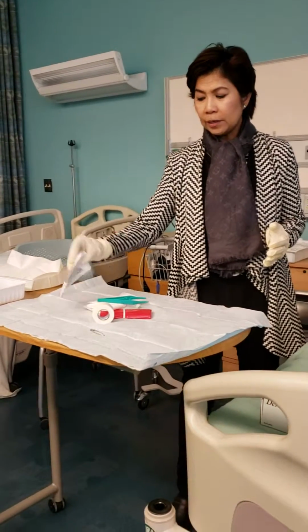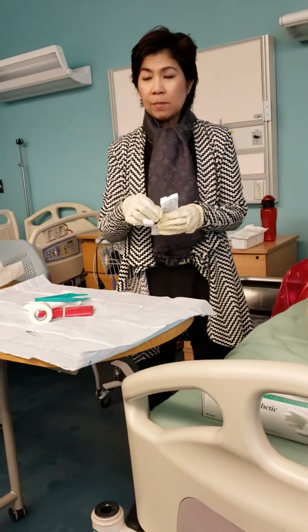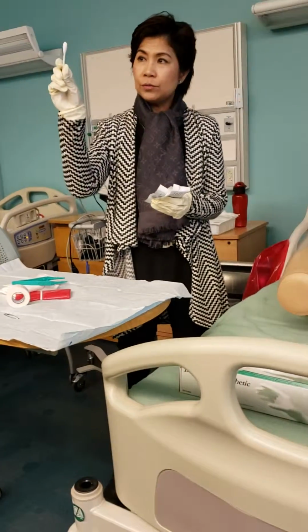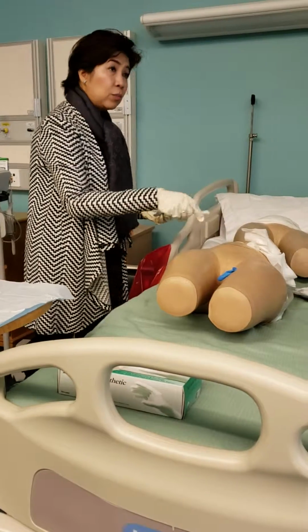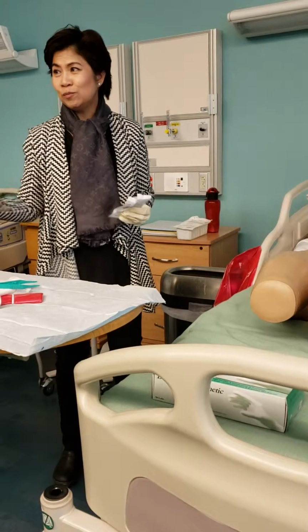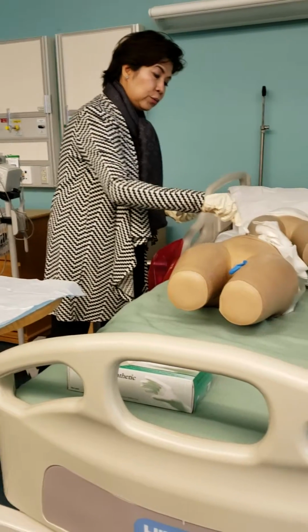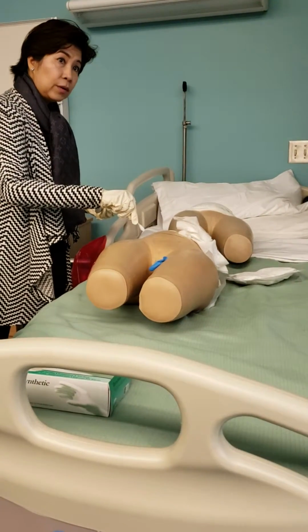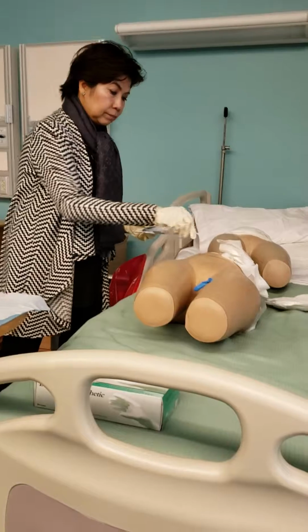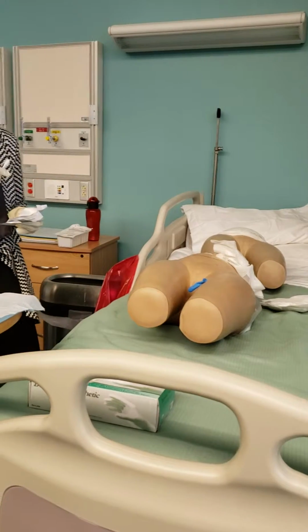Now, if this were medicated with betadine, then I can use this. So if this were medicated with chlorhexidine or betadine, what I'm looking for is that if this one is medicated and you swipe from top to bottom, you have to discard. Okay, I'm using that again, sorry. And then don't forget to clean the outside too, not just the wound itself, discard. Clean the outside and then discard. All right, that's your.